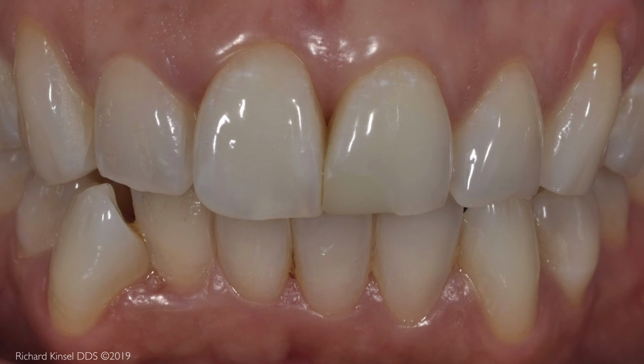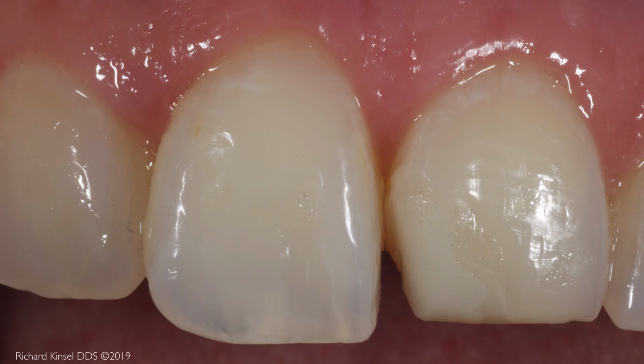Partial porcelain veneers offer a solution for the replacement of existing composite fillings. In this case, the central incisor filling is discolored and worn. The partial porcelain veneer only replaces the existing composite filling without removing additional tooth structure.